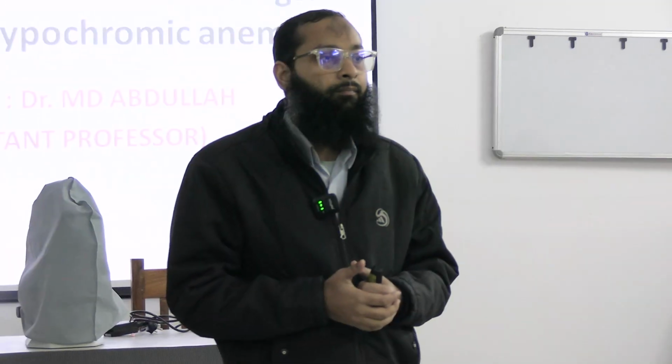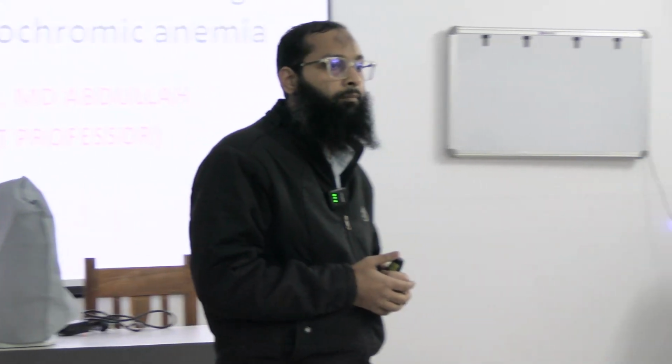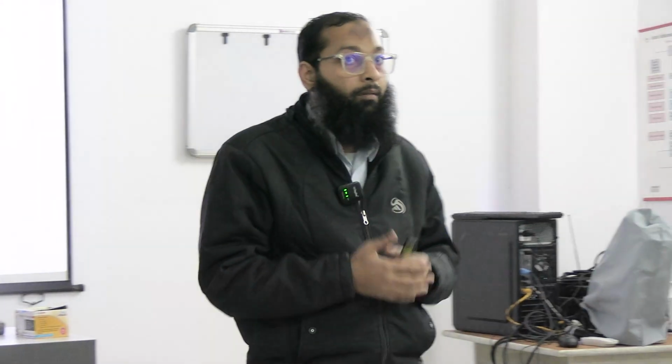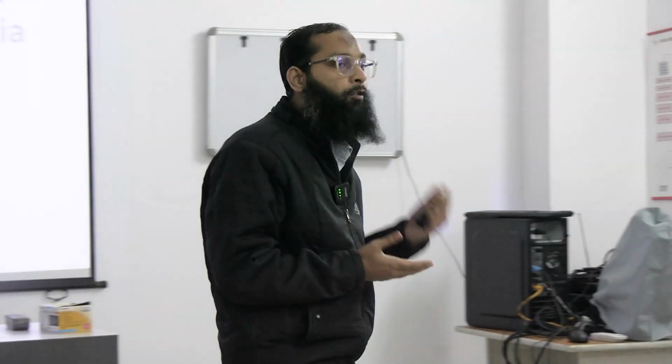Now, how will you stain? Which stain are you going to use? Leishman stain. Very good.